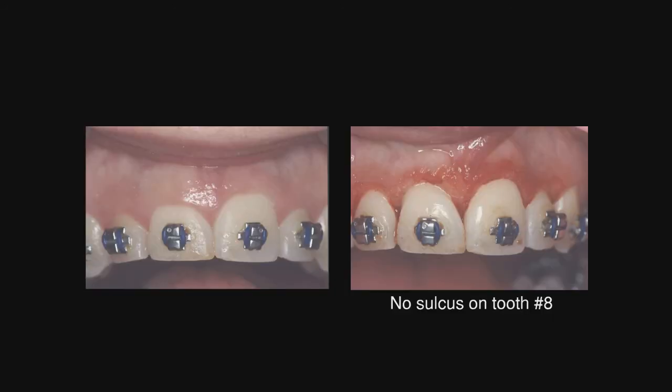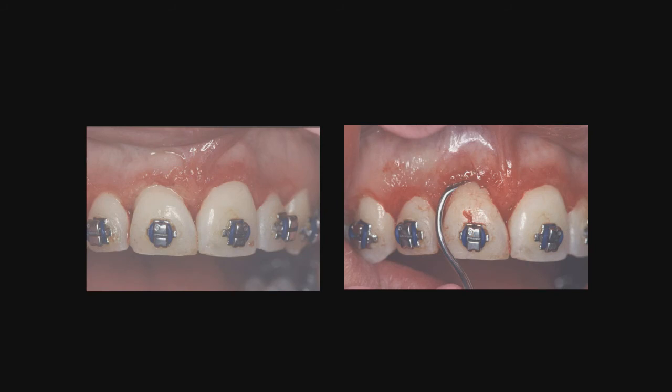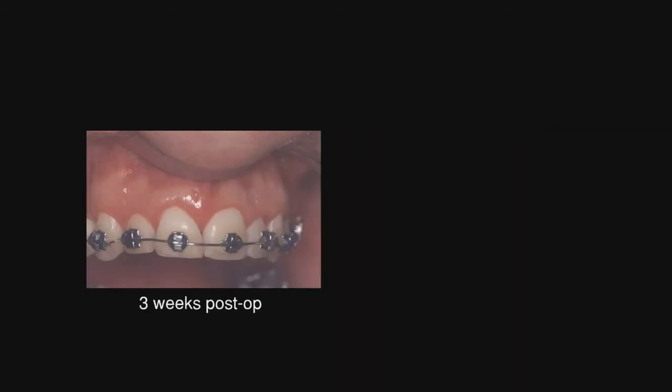And after going in and doing the radiosurgery, as you will notice on the right, we are right down to the sulcus, and if we stop here, that's totally going to rebound and look like the slide on the left. But what we did was make an incision from the mesial facial line angle to the distal facial line angle, and then took a curette and curetted off bone 3 millimeters from the margin to get the ideal gingival margin to bone relationship. And here we can see the little bit of bone that was taken out. And that, as I said earlier, the tissue level is 3 millimeters from the crest of the bone, which is ideal.